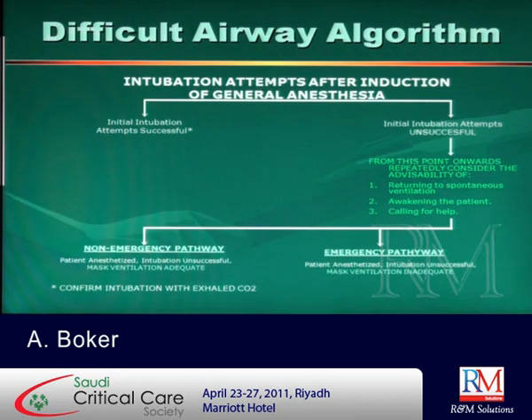Of course, there are three very important things that you did not yet mention. For intubation now. Excellent. Change the type of the blade and change the size of the blade. If you're using straight, use curved. If you use curved, use straight. We talked about Miller. And the size. If you use three, use four. If you use four, use three. And change the neck position, okay? The neck position is very important because the patient might not be in sniffing position, so you optimize. So you need to consider all these options.